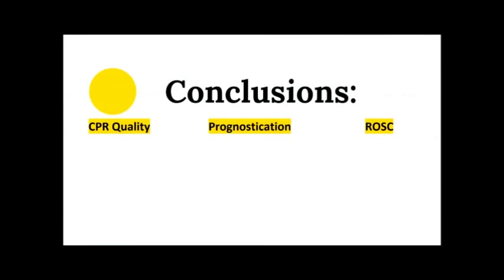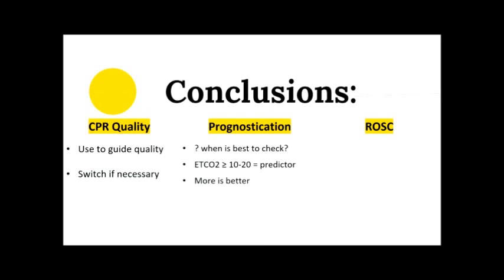So, conclusions from this overall section. With respect to CPR quality, it's good to use it to guide our CPR quality. If we start to see a declining waveform, switch that compressor before 2 minutes; they're likely tiring. We don't know the best time to check. Is it initial? Is it at some point? Is it 20 minutes on? But if that patient does have an end-tidal CO2 greater than 10 to 20, it is a predictor of ROSC itself. And the higher the number, the better it is.